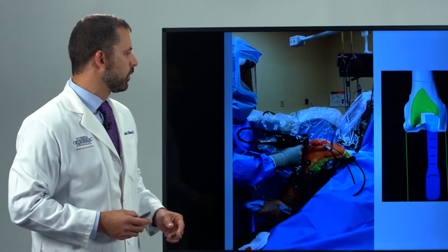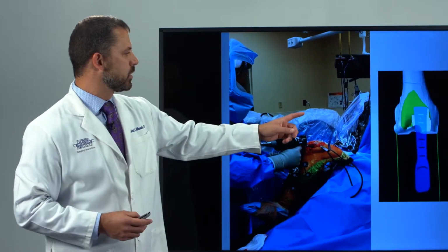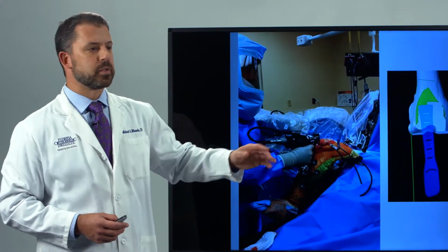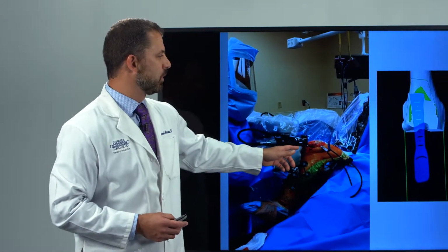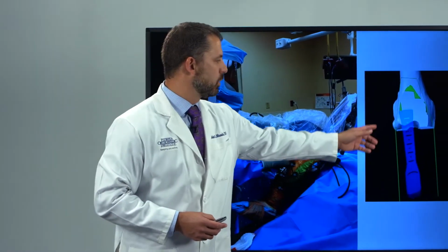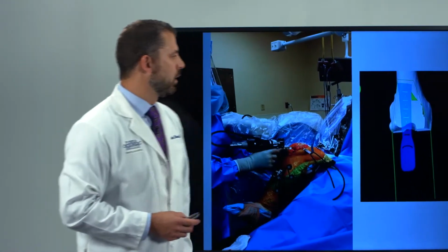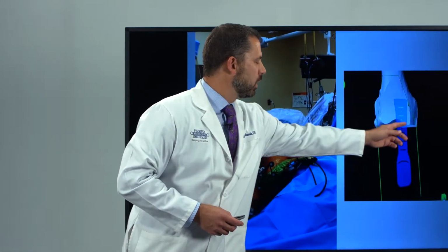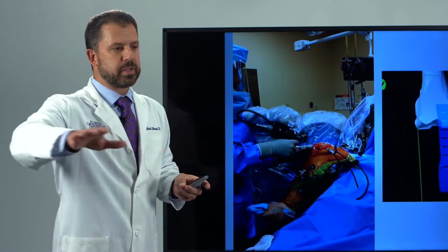So then we're looking at the knee and at this picture here, which is on the monitor up in the room, and you can see when the bone is resected, the green is removed. That correlates with the amount of bone that's being resected, and you want to make sure that you get the majority of all this with the saw blade. And these parameters, the green border here, the saw cannot go outside of those parameters.